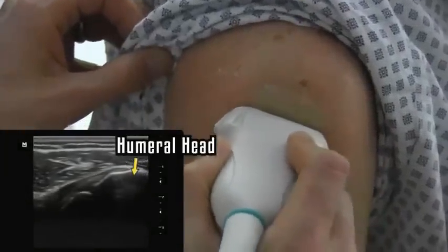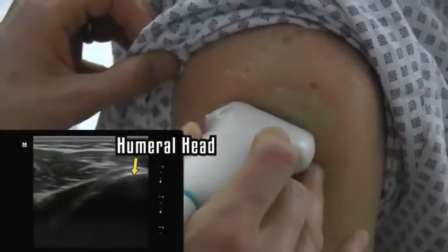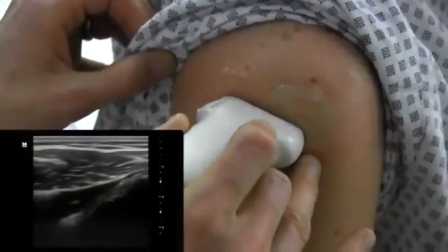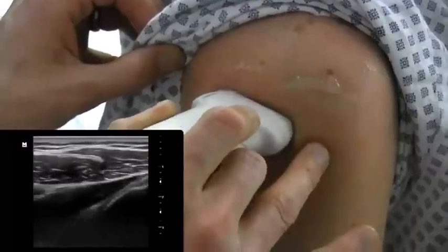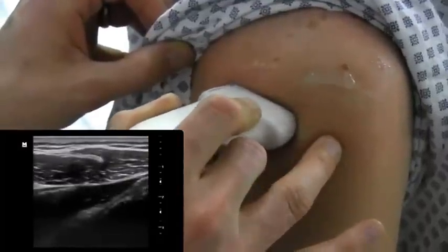Once you find the humeral head, you're going to slide the probe more posterior. You're going to be looking for the articulation where the humeral head comes into the glenoid.